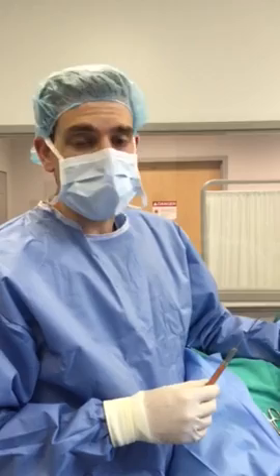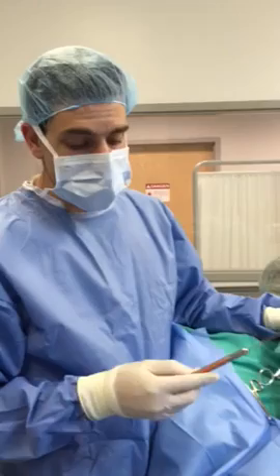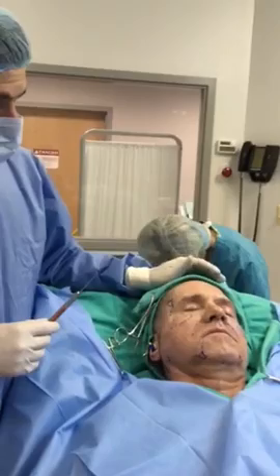I'm Dr. Jared Malilou from the Laser Center of Maryland and today we're talking about fat grafting. We have our patient here — we've harvested just a little bit of fat from his waist. We're taking out a little bit of fat that he didn't need or want anymore, then we purify that and put it in these little syringes here.